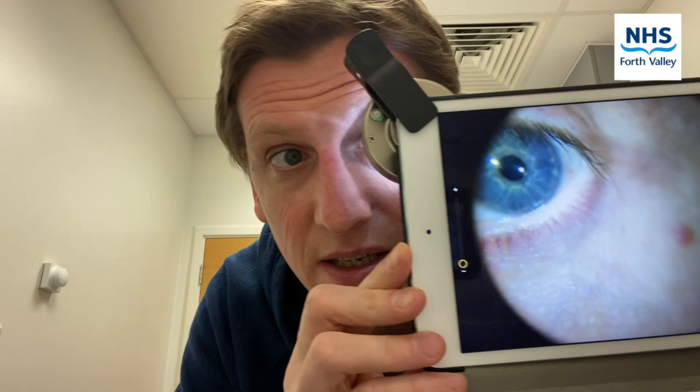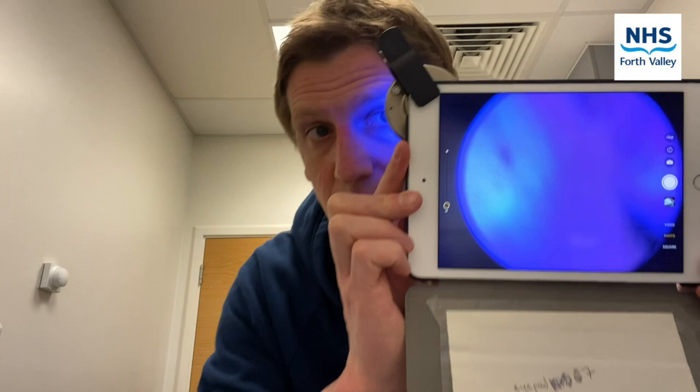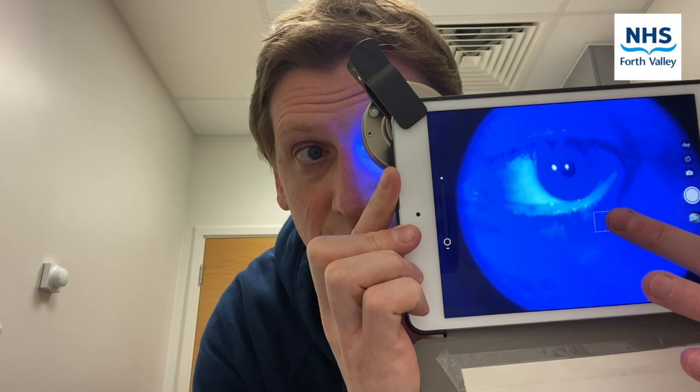You can do some minor adjustments to make sure you've got a good centralized image. I'll do a selfie exam to show you how it works — I'm putting the white light on. This is quite an elegant way to examine a child, a multi-trauma patient, or a patient that can't posture at the slit lamp. With the blue light setting after fluorescein goes in, you can do finer adjustments by pressing on the screen and adjusting the exposure as needed. So that's the Photobluminator 2.